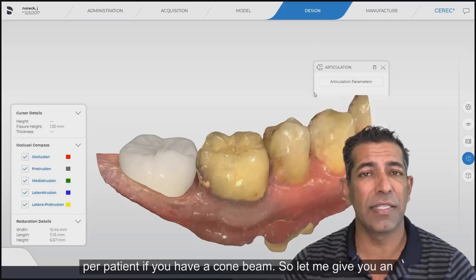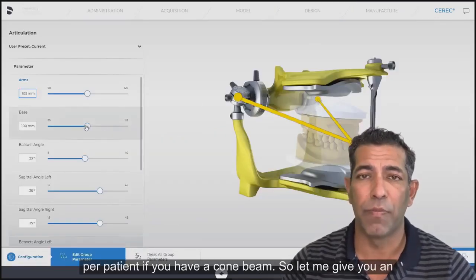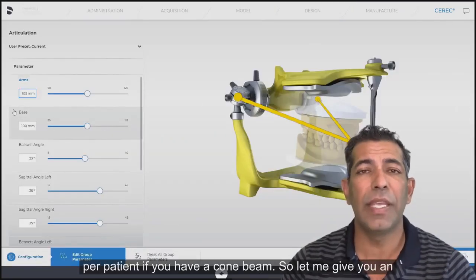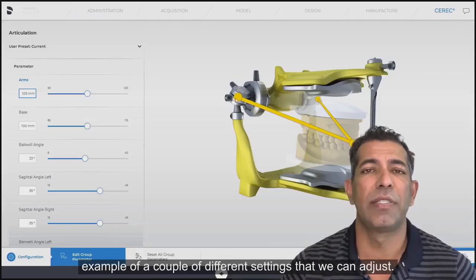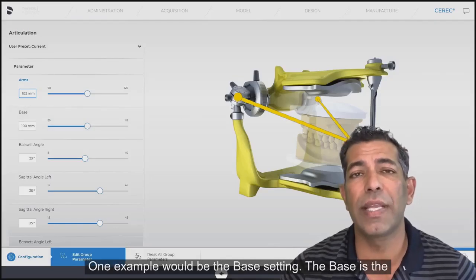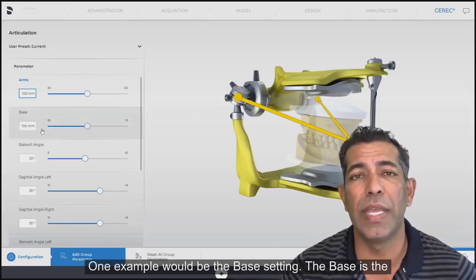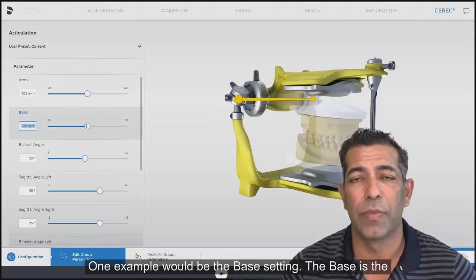We can dial this in per patient if you have a cone beam. Let me give you an example of a couple of different settings that we can adjust. One example would be the base setting.